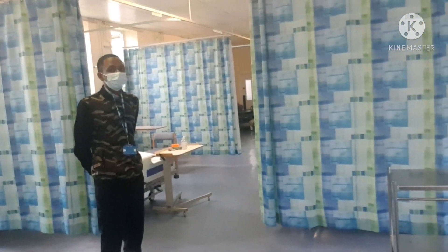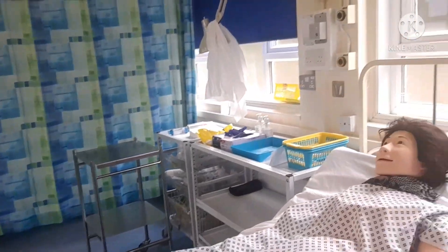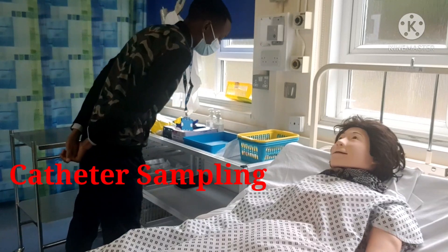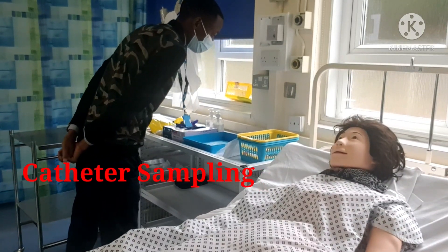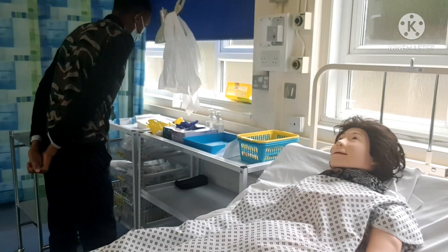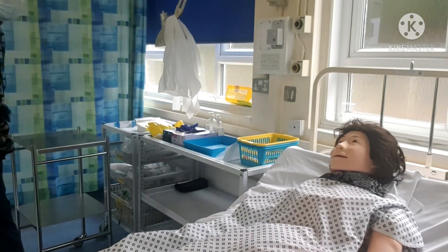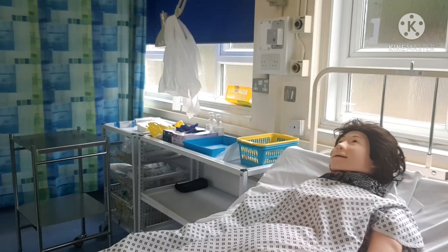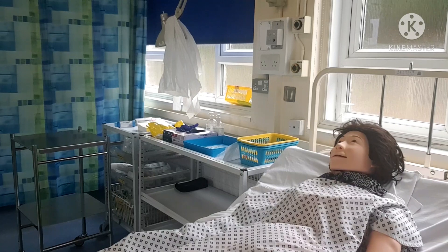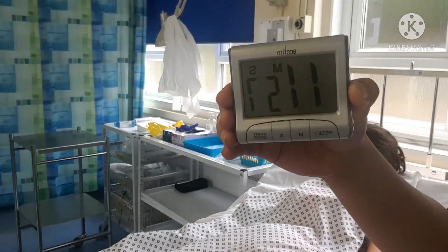Candidate, are you ready? Yes, I'm ready. Okay, you want to look around first before you proceed? Yes. So this is your station — you're going to do a catheter sampling assessment. Your clinical scenario: the patient is in the hospital. When you're ready, your timer starts now. Then I'll put the scene out for scene safety.